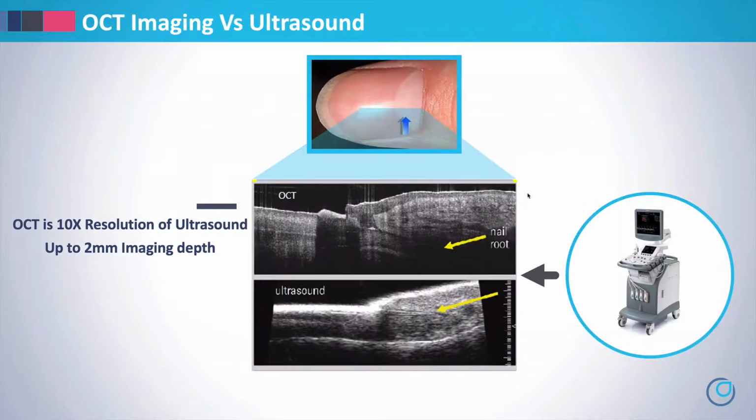So we said OCT is similar to ultrasound. We see it here compared again when we look at the nail bed. You can see the area that's being imaged reflected here. This is OCT data. Compared to ultrasound data, you can see much higher resolution that we achieve with OCT. This figure shows very good anatomy of the nail structure, sterile matrix extending back into germinal matrix and the dorsal roof of the nail. This is the same anatomy shown with ultrasound.